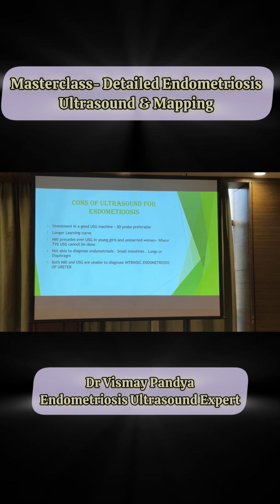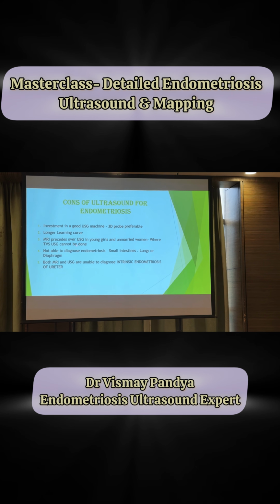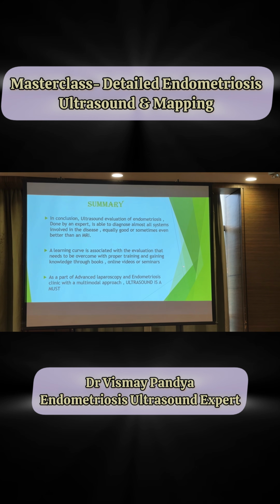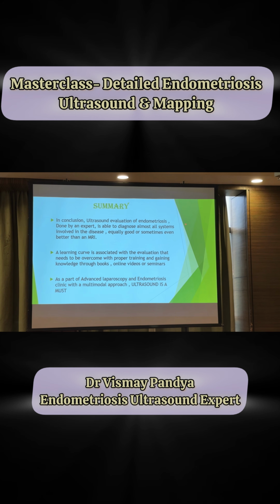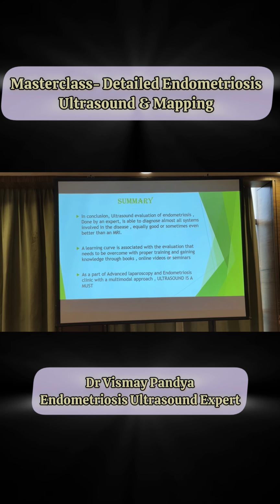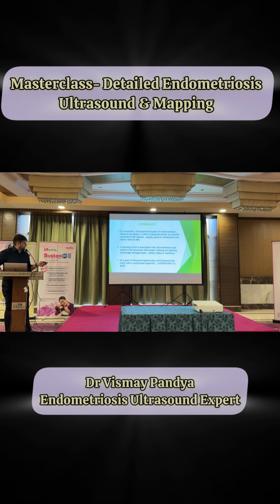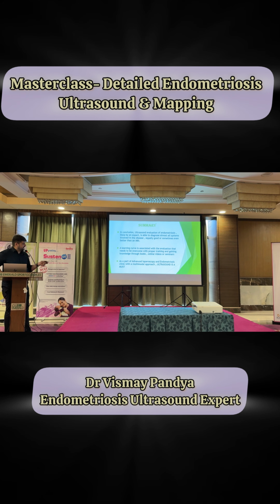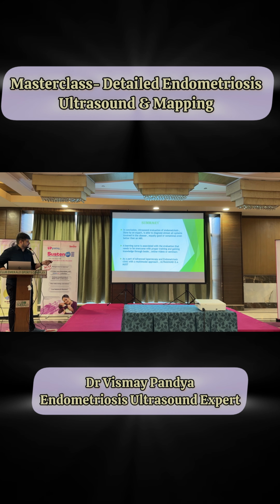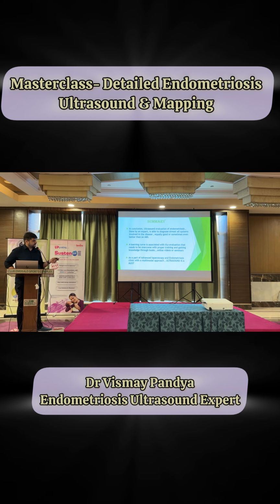Cons, of course, it is not for young girls and unmarried women who do not allow a transvaginal sonography. And yes, there is a learning curve associated with the evaluation that needs to be overcome with proper training. And yes, there is a lot of material available online. If you are starting a center for advanced laparoscopy and an endometriosis clinic, ultrasound is a must. It is a modality you cannot miss.